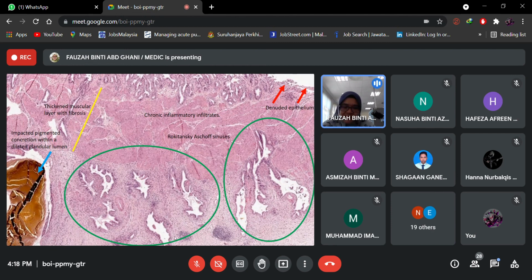Okay, so kalau kita go higher power view, these glands are bland looking, means that dia nampak macam normal looking. It's not, bila kita nampak macam our principle of bila ada glands and go beyond the muscularis mucosa or beyond the, I mean, the muscularis propria and all that.